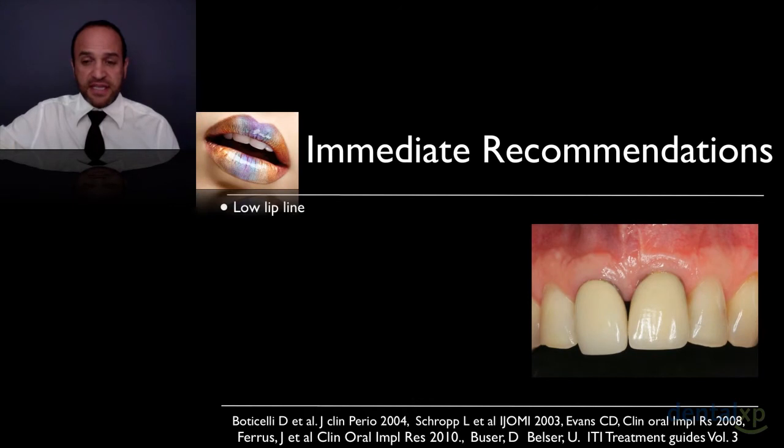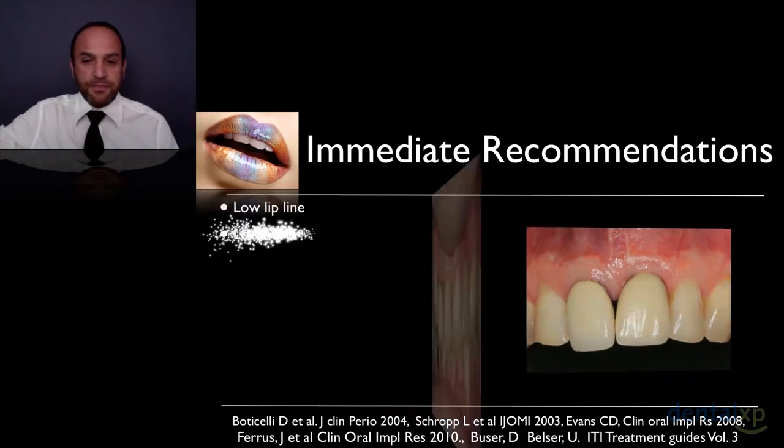And here you can see the case. Again, retrofitted old crown. This patient won't come back for any final crown because he's been walking around with that crown for years. And I keep telling him it's going to break, it's going to come off, but it's now 5 years later. And he's happy. He's got the gingival recession problem, etc. But it's not a problem at all because he's got that low lip line we just showed.